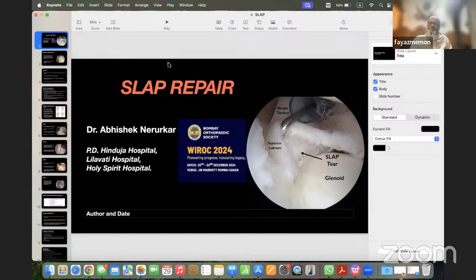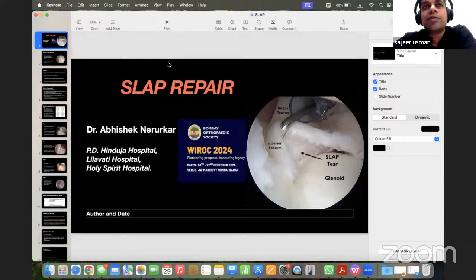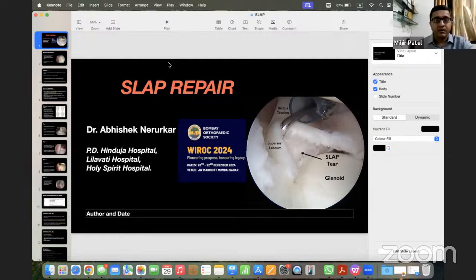The remaining anchors, I'm not so keen on putting right on the face of the glenoid. I would even go on the edge of the glenoid, because at the end of the repair, the glenoid articular surface seems to be covered with capsule, and that I do not really like. I'd really like to see the middle third of the glenoid exposed. So for me, the most important anchor, the 5 or the 6 o'clock anchor, whichever one prefers, would mostly go slightly on the face.